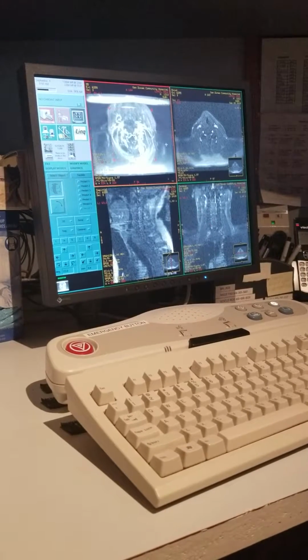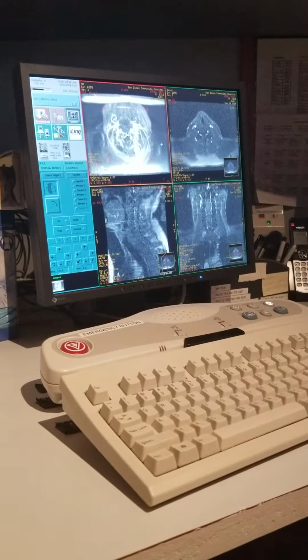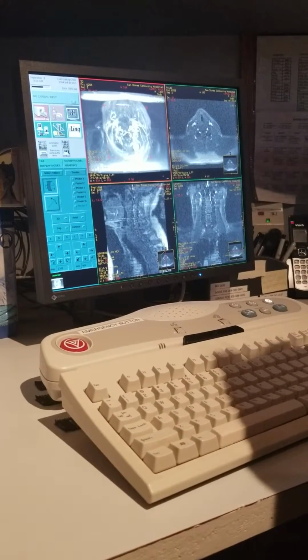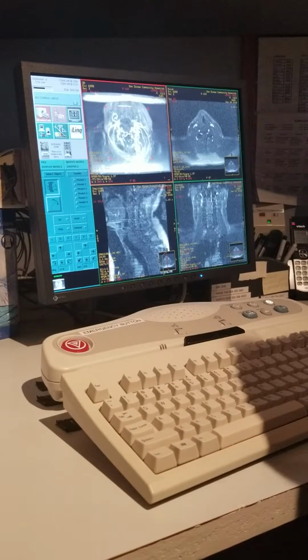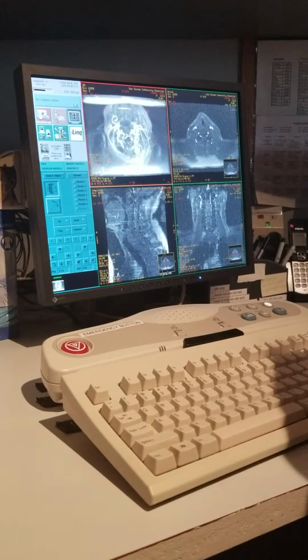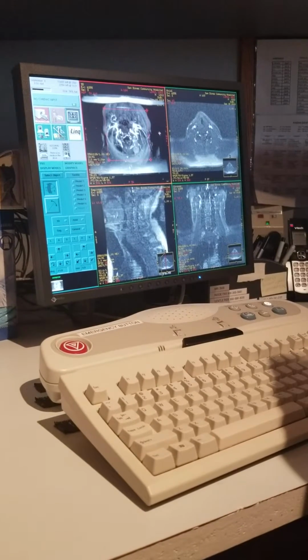A lot of people call it MIPing, but this is actually the MIP, and we're going to do IVI on the MIP. So take the brightness out of the vessel. It's too bright. You're not doing it right. Set it off.